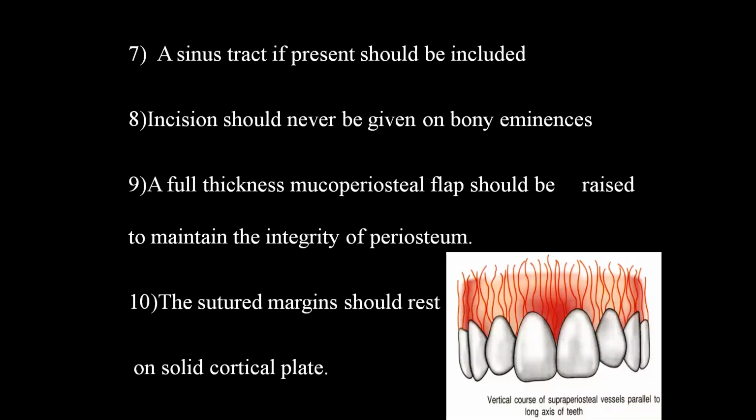Okay, and if a sinus tract is there, it should be included inside the flap, and an incision should never be given on bony prominences, such as the canine prominence. And a full thickness mucoperiosteal flap should be raised to maintain the integrity of the periosteum and postoperative healing.